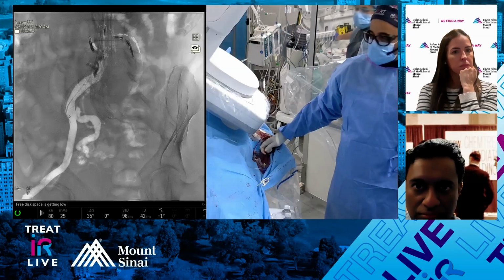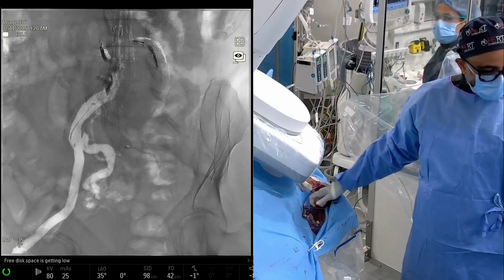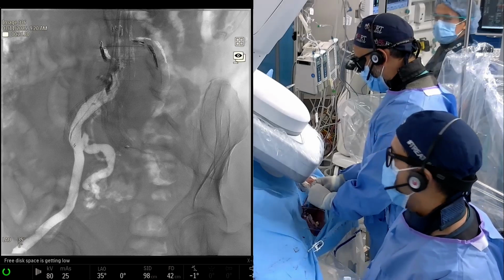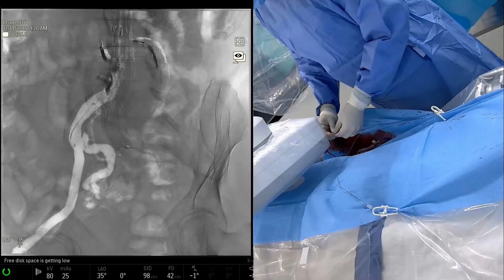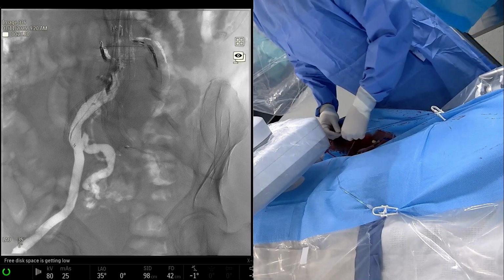I've had some bad experiences pushing Amplatzer plugs from the wrist, especially through a guide, because the long guides from the wrist are kind of soft, not short. And in terms of recapturing them, I've gotten burned once, so I'm a little shy. But the Amplatzer 4s, we've been okay with those going from the wrist.